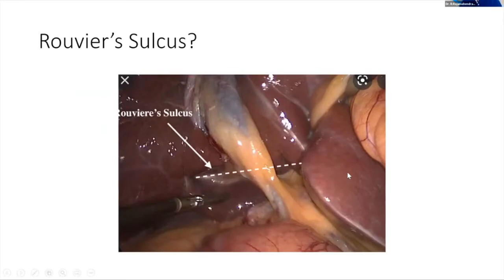Another important anatomy, as this is not important for MBBS students and PG aspirants, but this is a classical important line when you are doing laparoscopic cholecystectomy practically. The moment you put a port and you pull the gallbladder, push the gallbladder towards the fundus, you can see one sulcus here. This is a very, very important sulcus. This is the inferior most point. I should not go below this point. While I'm doing surgery, I should always stop my dissections, everything above.